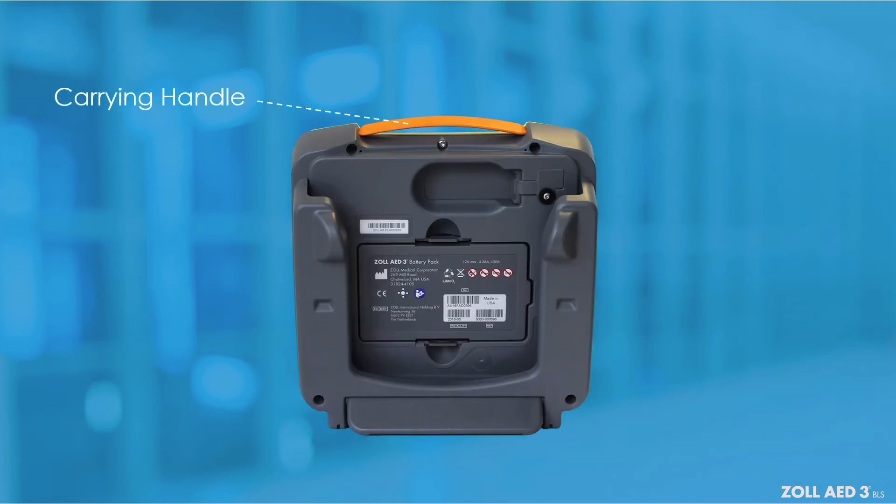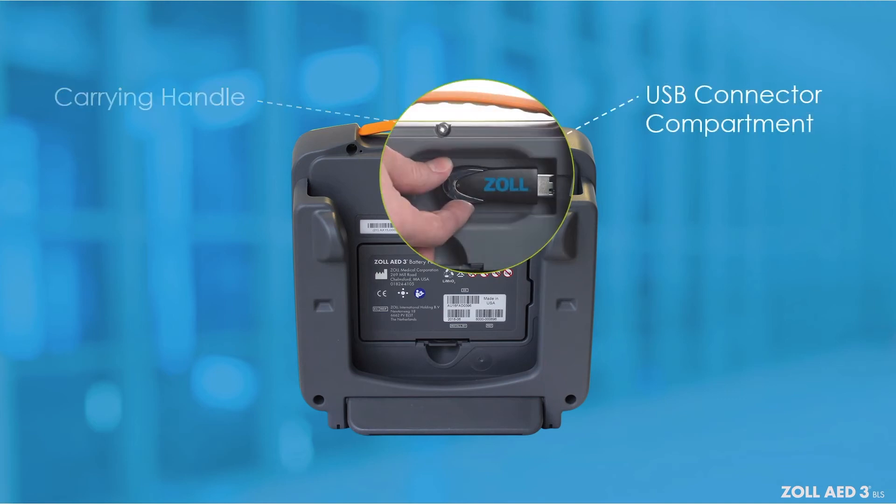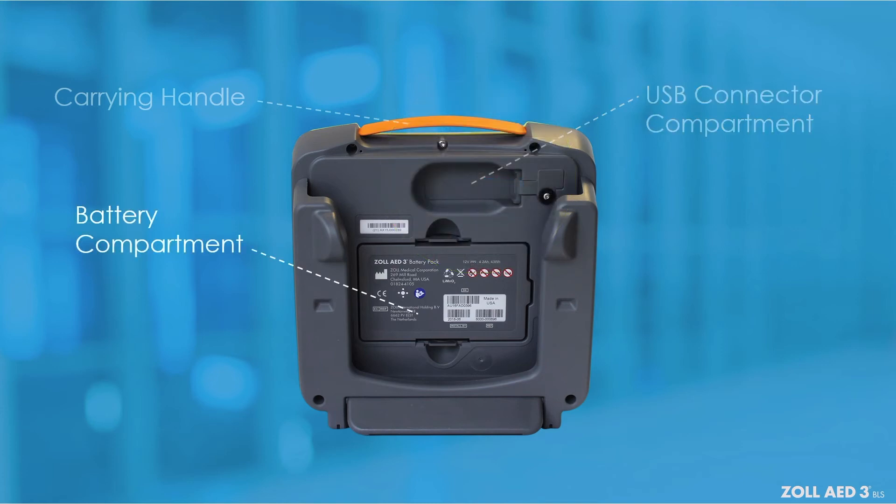The carrying handle makes it easy to carry the AED. The USB connector compartment is used to connect a USB flash drive when importing or exporting files to or from the Zoll AED-3BLS defibrillator. The battery compartment holds the battery pack used to power the AED.